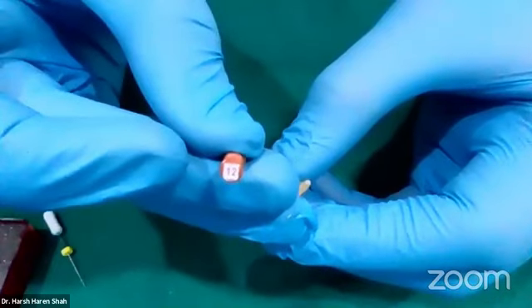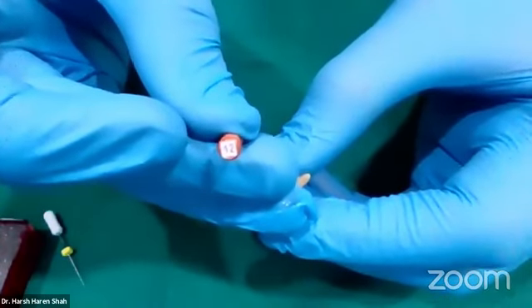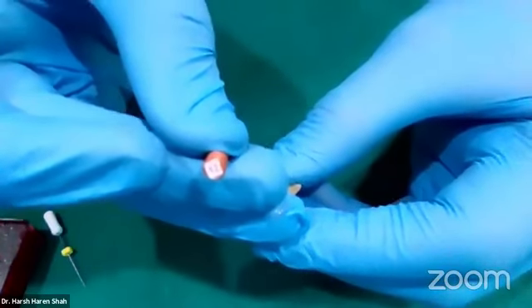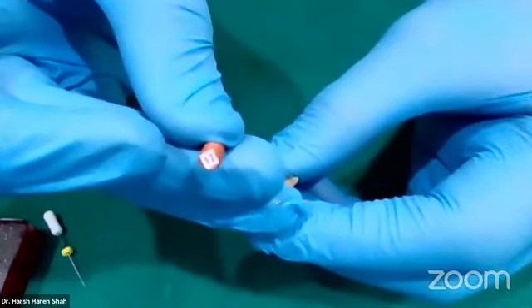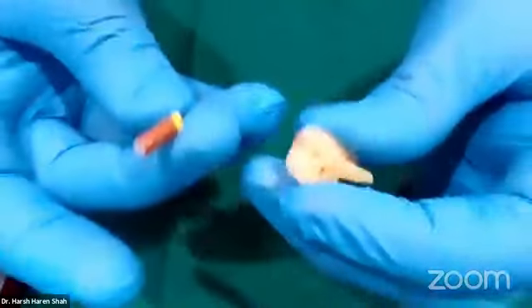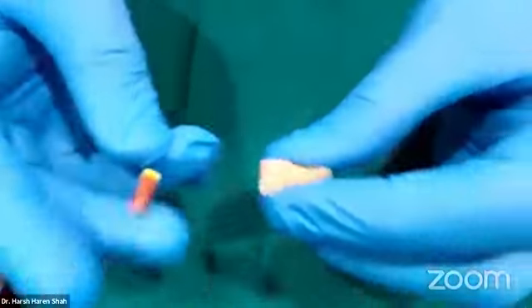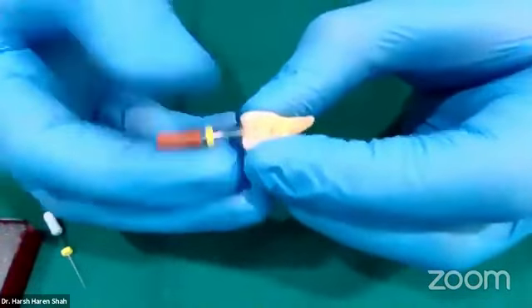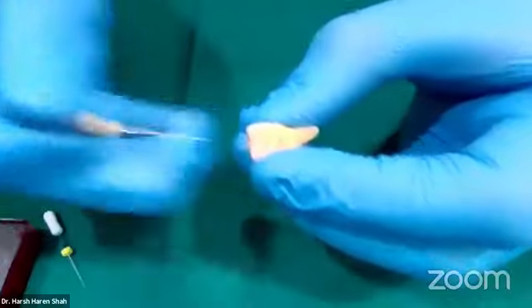So this 12 number K file is a middle file between your 10 and 15, because the jump in diameter between a 10 number and a 15 number is massive. These kind of 12 number files are available. The one that you see here, the orange colored one, is a Dentsply 12 number K file. You could use this in between only if you feel the need. Otherwise, you can directly go to a 15.